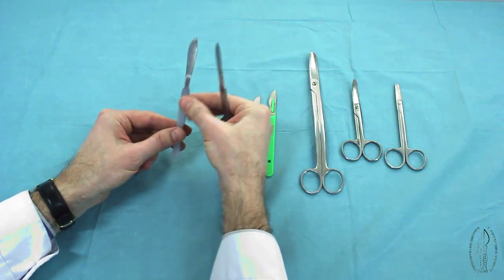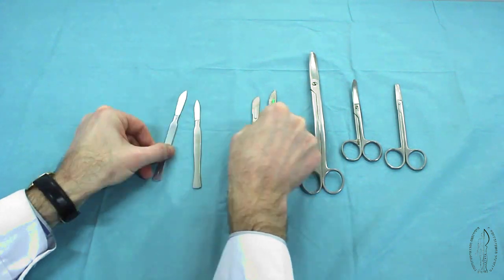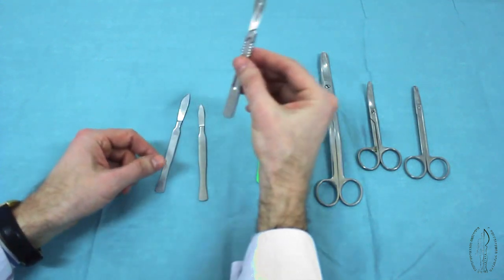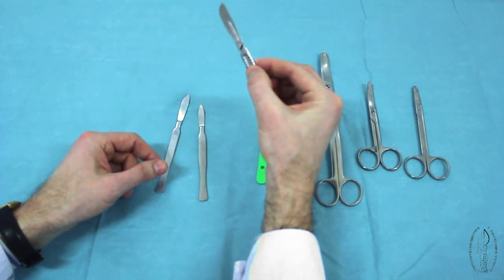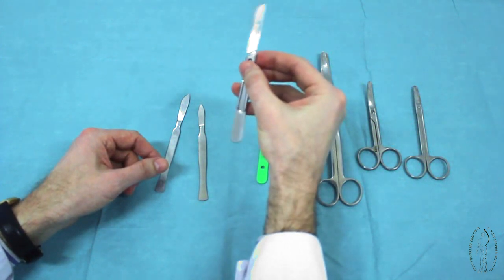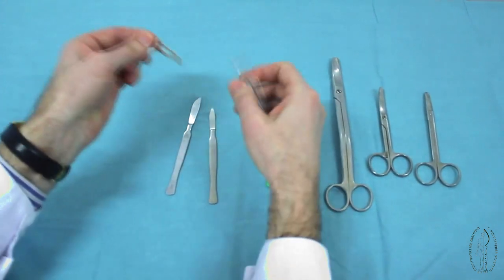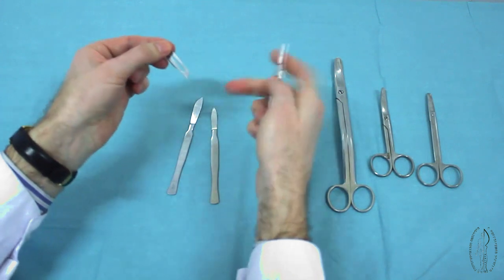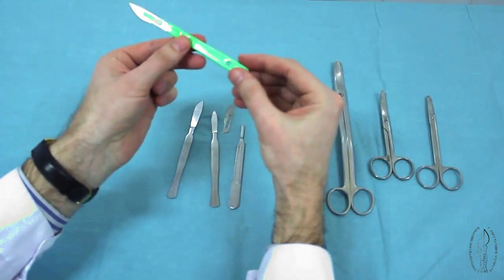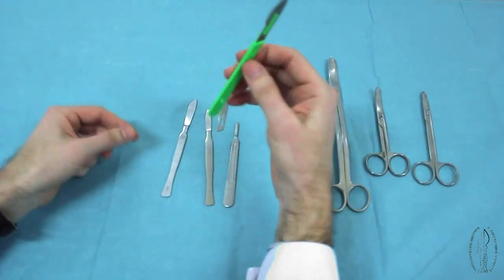These both scalpels are whole metal and can be repeatedly sterilized. They have a disposable removable blade and reusable metal handle. These scalpels are disposable because they have a plastic handle and can be used only for one operation.